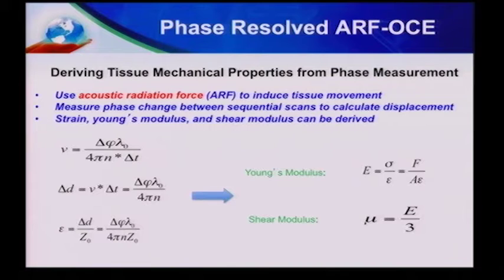With that technology, what we measure is the speed from the phase change, and with the time window, you calculate the displacement. From that, you can look at strain, and then if you know the force, you can calculate the Young's modulus. If you know the Young's modulus, you can calculate the shear modulus.